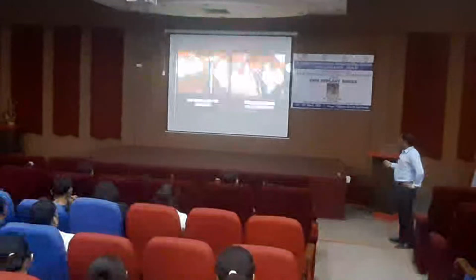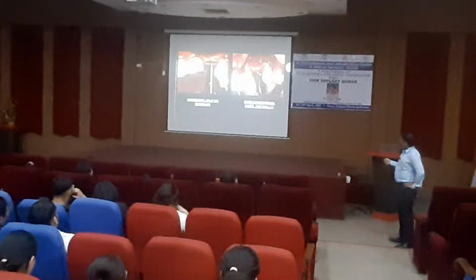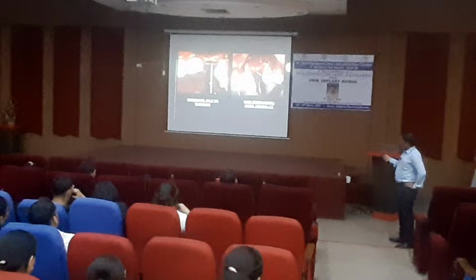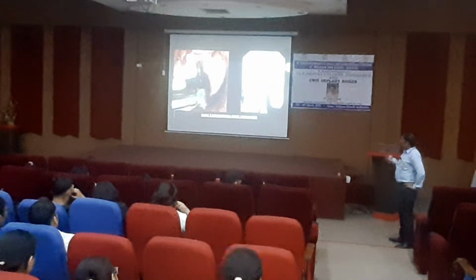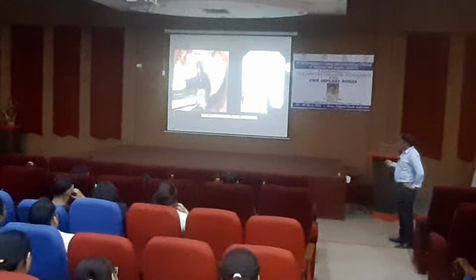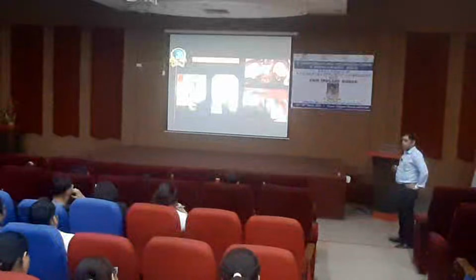This is the first lancet to check whether I am in the center or not. Then this is the crestal ridge bone expander. This is the old one, like the chisel and mallet we showed just now. Then the motorized expander to expand the bone, and after that the placement of the implant.